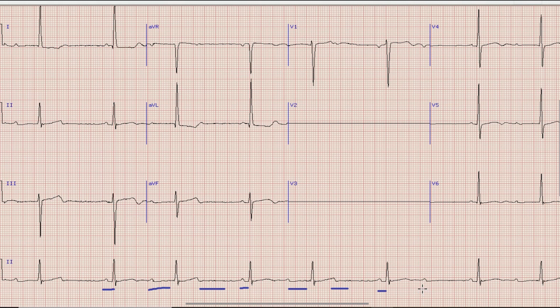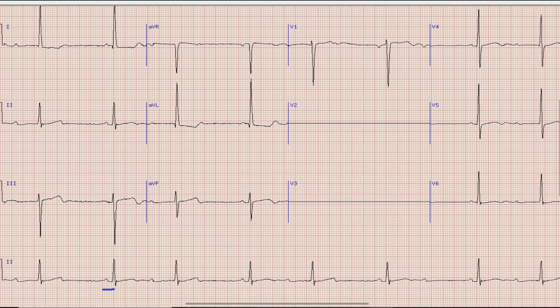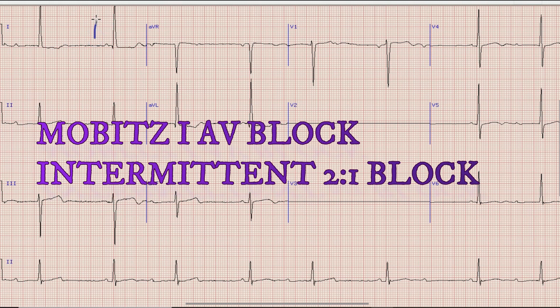After a short PR interval, the very next P wave is not being conducted. The P wave after this QRS complex is not conducted, and after that there is again a short PR interval followed by a prolonged PR interval. So we are seeing two different phenomena: progressive prolongation of PR interval with a dropped QRS complex — typical of Mobitz I or Wenckebach — while towards the end of the rhythm strip there is a sudden drop of QRS complex after a P wave, which is 2:1 AV block. So here we have Mobitz I AV block with intermittent 2:1 AV block.